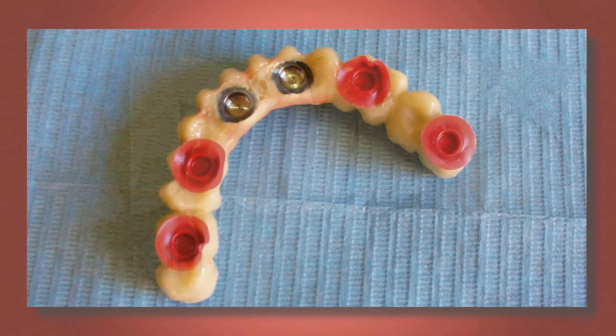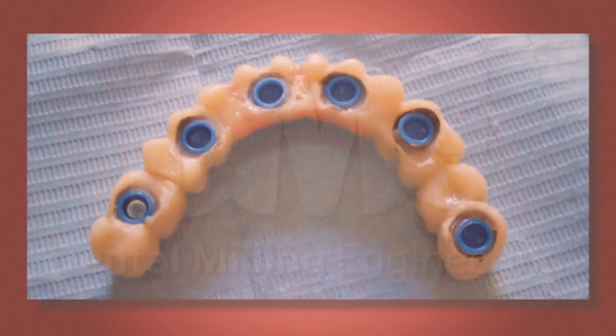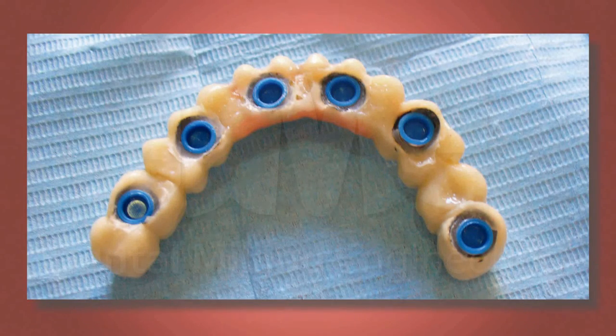After the removal of the containers, we proceed to remove the excess cement, if any, preparing to place the indicated retainers appropriately. In this case, the retainer which was chosen is the 2 kilos retainer, as the doctor has decided to carry out a test within 15 days to determine whether to keep the same retainers or replace them with the 3 kilos ones.